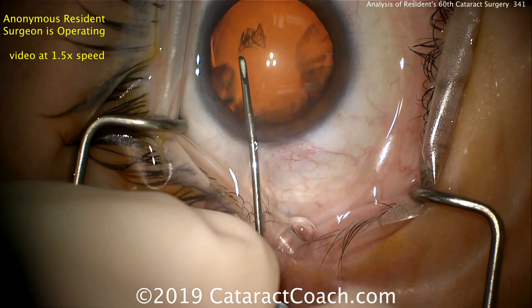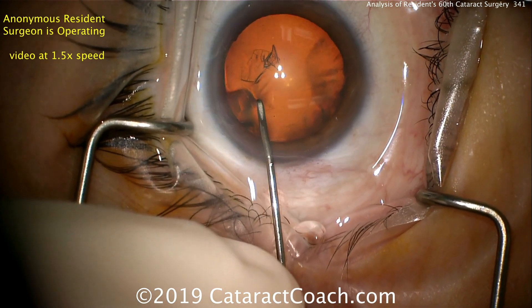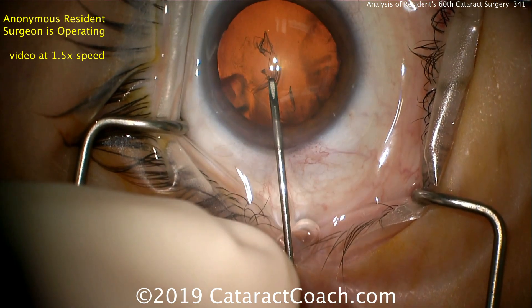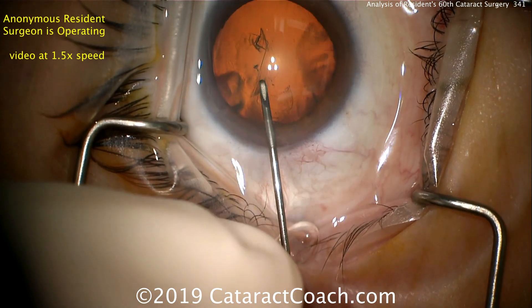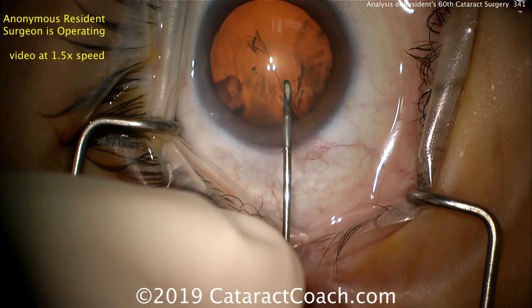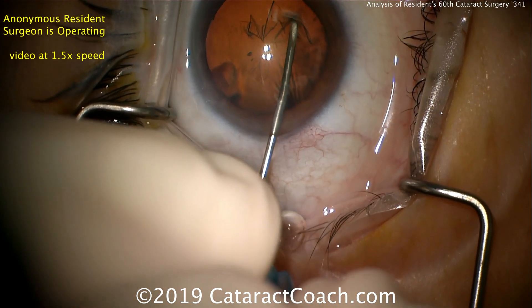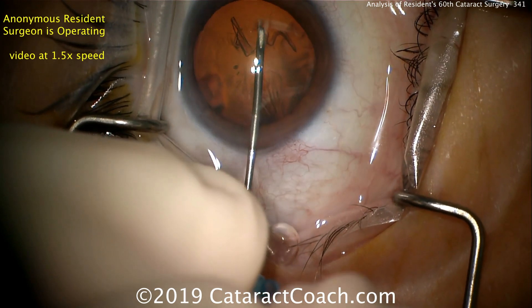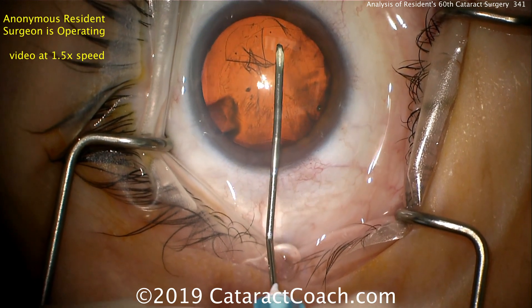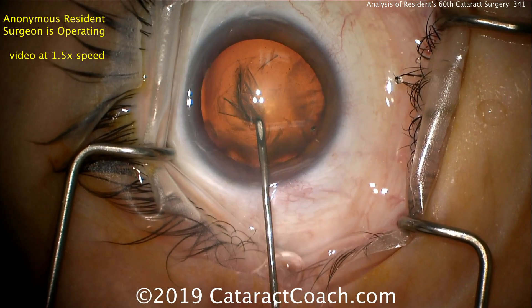Poking in the center and starting the rhexis here, and that looks really good. Completing the capsulorhexis here with just the cystotome. This is a good thing to practice because it really helps you build hand-eye coordination. If you dig too deeply you'll damage the flap or go into the cortex — you have to get it just right. I like that the resident's doing it this way. More viscoelastic was injected to help keep the anterior chamber inflated, and that looks great.